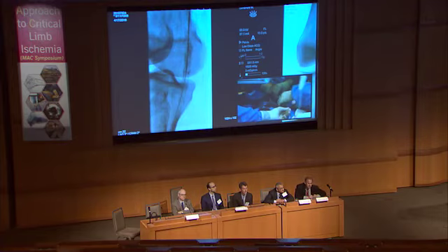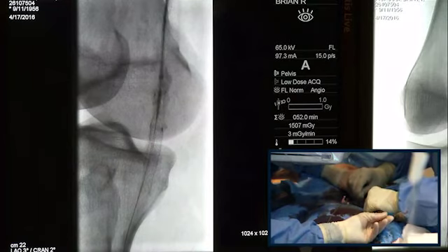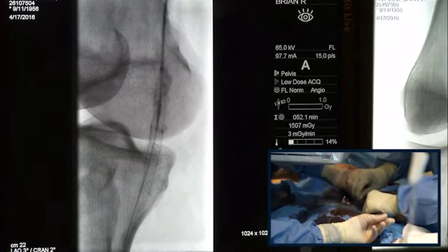So elongated a little bit there. I'm having obviously a little bit of a challenge here, but yeah, it's a tough case. I mean, this has been a tough case from the get-go, and there's not a great option in this kind of calcium. And as you could see, even from the multiple surgical procedures, even that was fraught with problems.